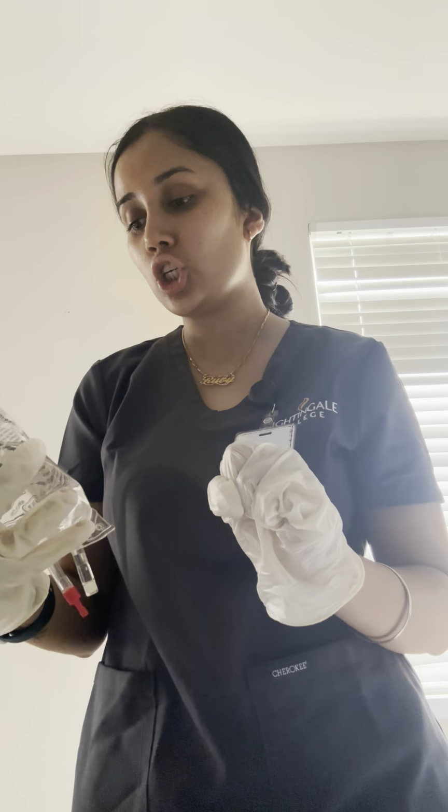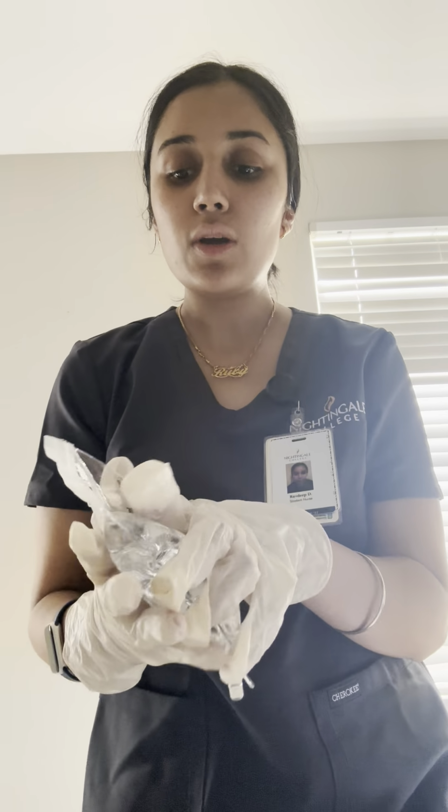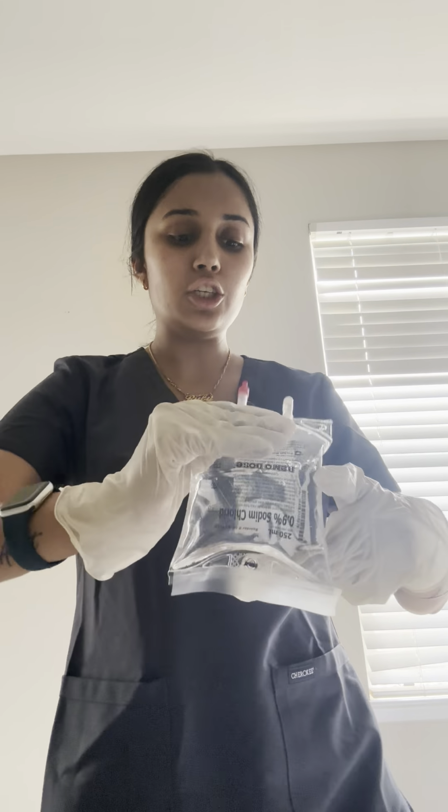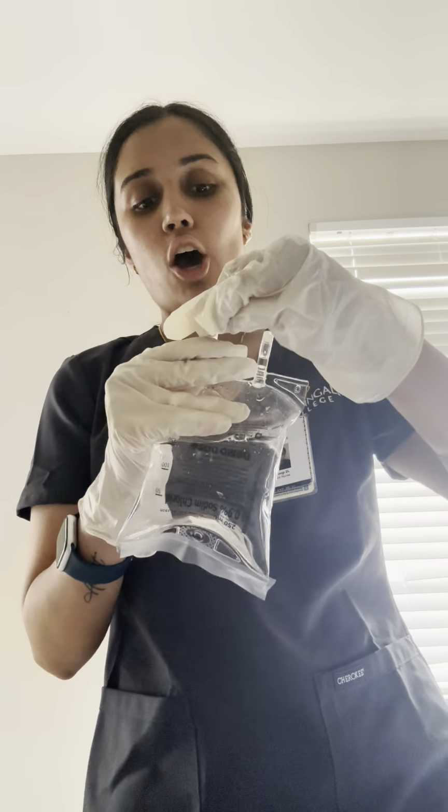So the next step in the procedure is you would want to confirm your orders with the MAR, so I've already done that. And then I've grabbed my primary fluid bag, which is normal saline. I want to make sure that it's the correct fluid, the right dose, and then I want to make sure that there's no holes or tears in the bag itself. We also want to check the expiration date to make sure it's not already expired, and if it is, you would discard it and get a new one. So what you would do is turn this towards you so the red cap is facing you, and then we would twist off the cap.